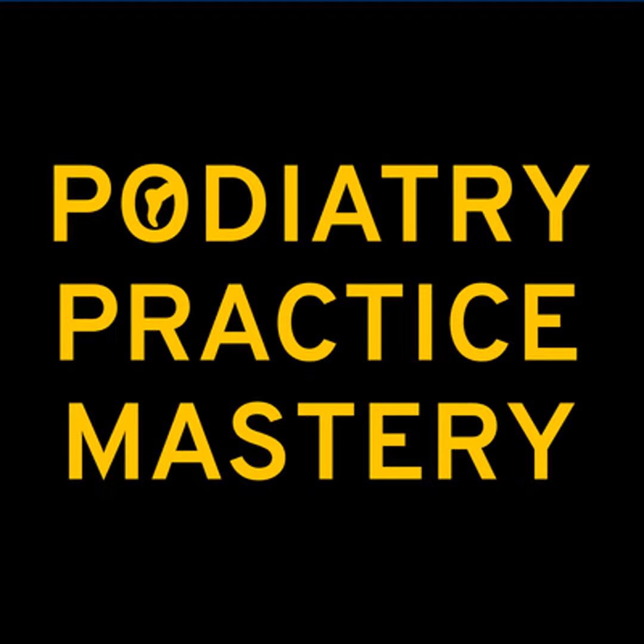Well, let me also give you, I'll send you a link to put in the show notes. Two lectures I have as the medical director of ProLab. We have a ton of webinars and lectures there, but there are two I would look at. One is how orthotics function. It's the modern take, I mean the latest literature on how orthotics actually function. Orthotics, for example, do not predictably change alignment. They don't function through kinematics. They function almost exclusively through kinetics. They change forces, not position. And understanding that plays a big role in being confident in how you prescribe these things.